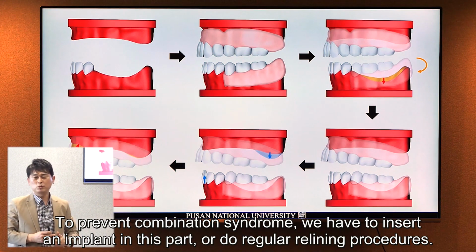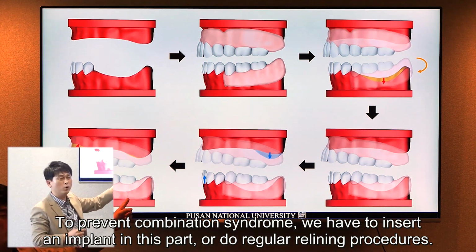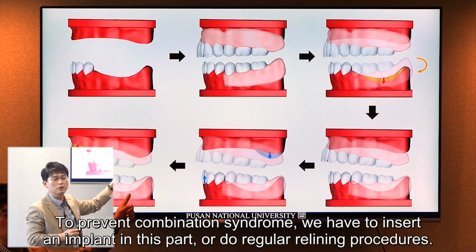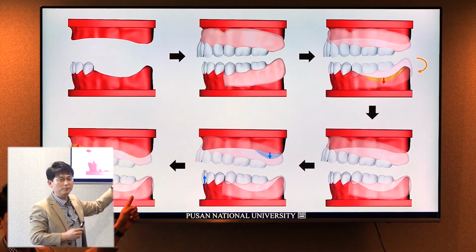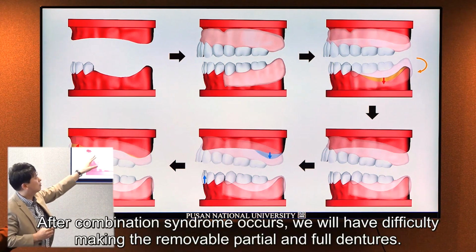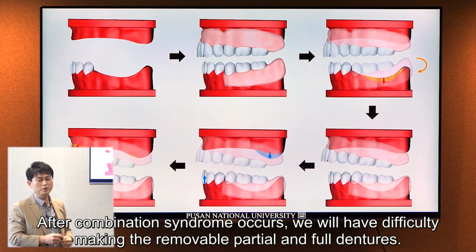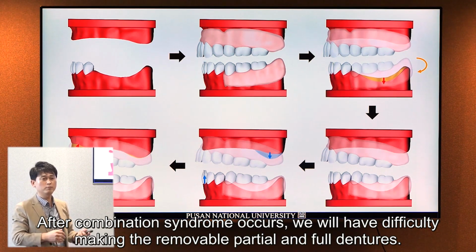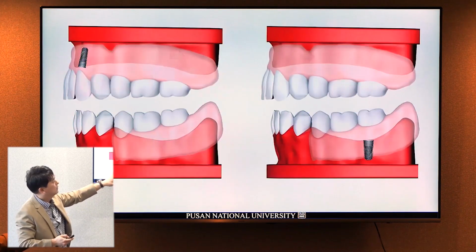So to prevent this kind of combination syndrome, we have to insert an implant in this part, or we have to do the regular relining procedure. After combination syndrome occurs, we have difficulty making the removable partial denture and full denture. So we have to prevent this kind of thing.